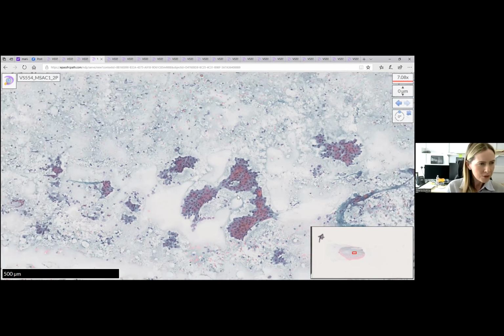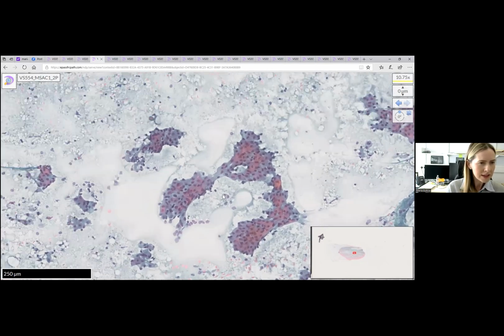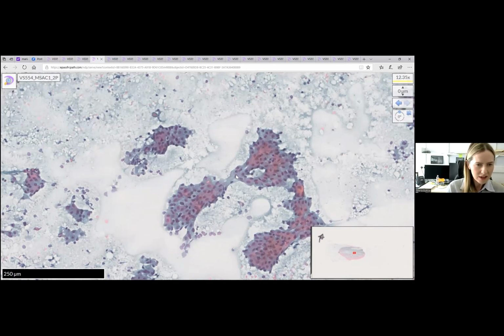So as you've all correctly identified, you can see this beautiful granular background, and with the small mature lymphocytes sprinkled in the background. And then we see these beautiful oncocytic epithelial cells, as you can see, sort of like strip sheets where they've all got uniform nuclei and abundant granular cytoplasm. And they sometimes can have a prominent nucleoli, but by and large are uniform.